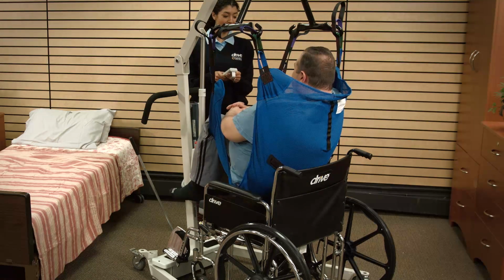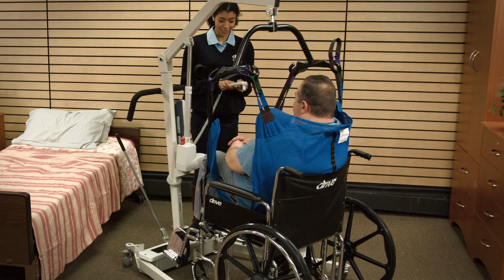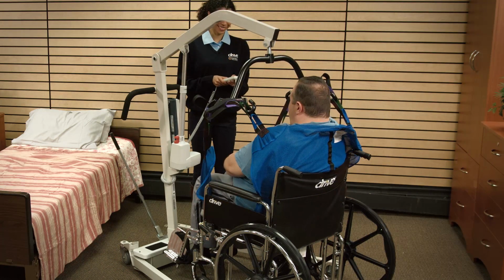When the patient is seated, press the down button on the handset to gradually lower the patient. The patient can remain seated in the sling.